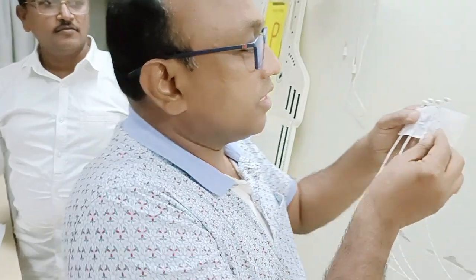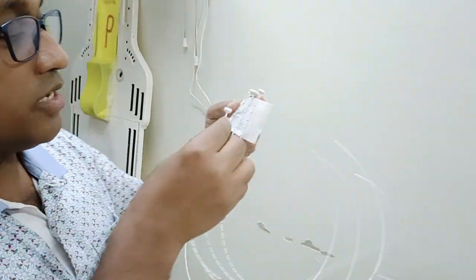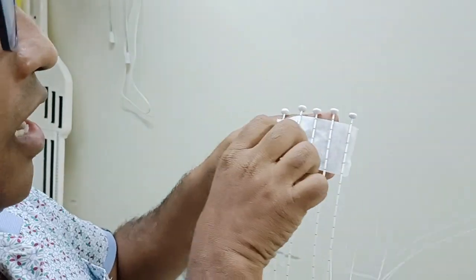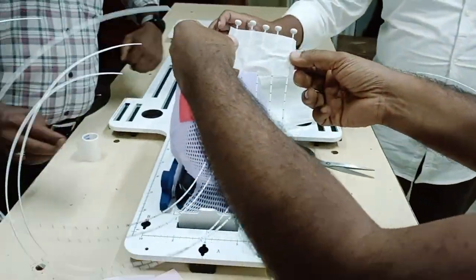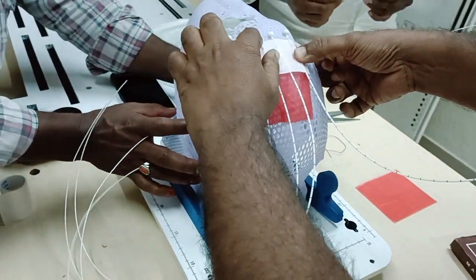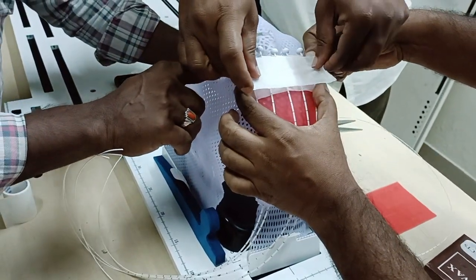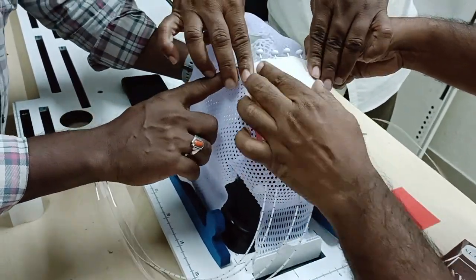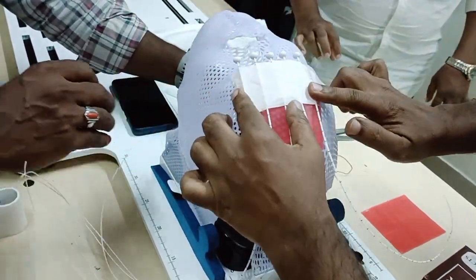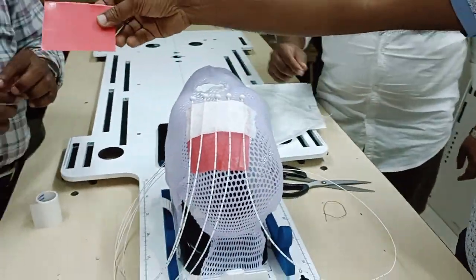Fix the wires into this mask area. The next step is to take one more wax sheet and melt it again.